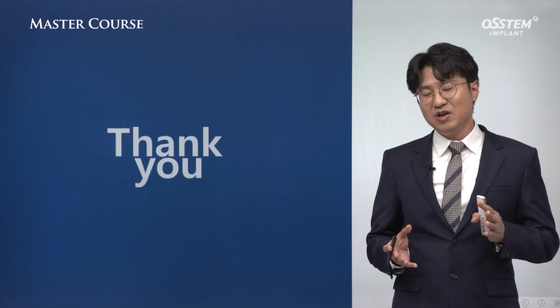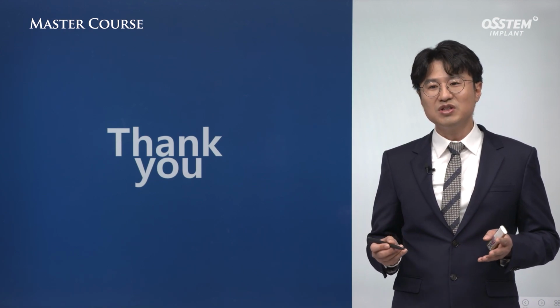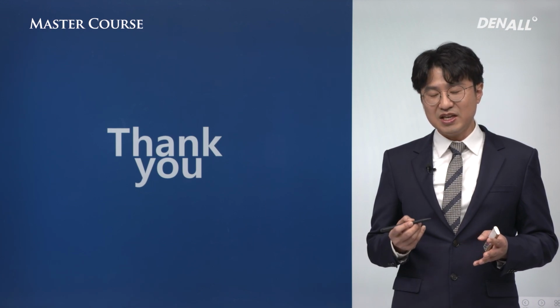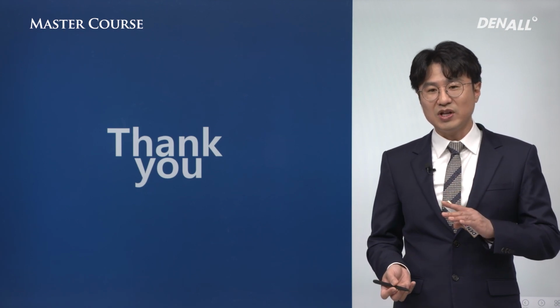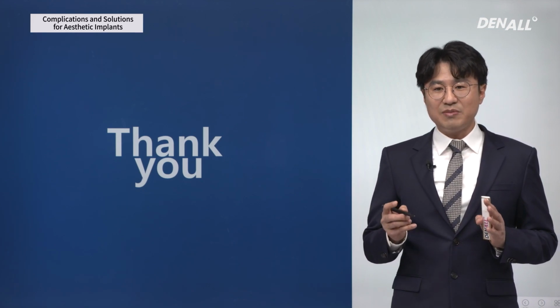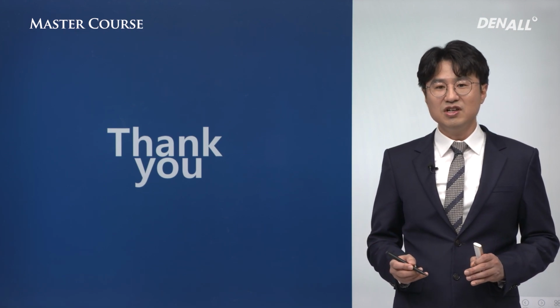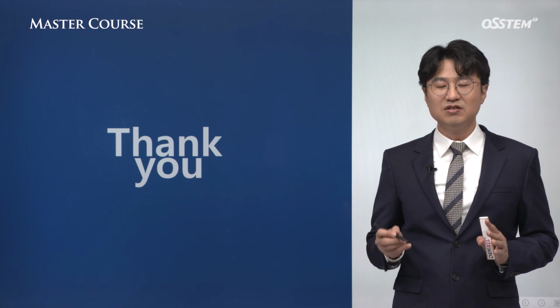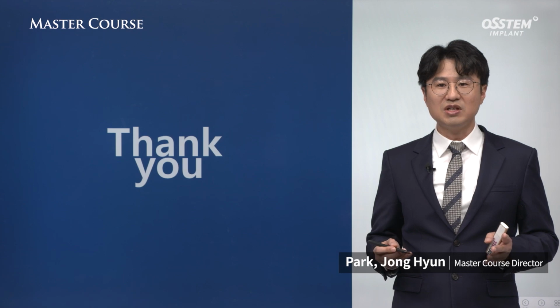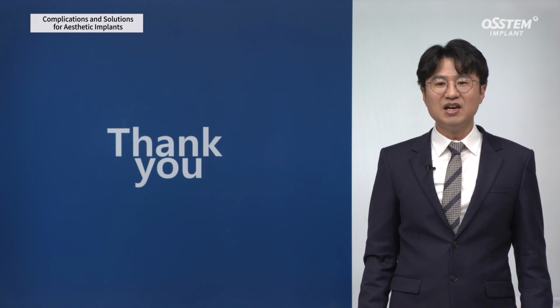This can lead to lower primary stability as the length and diameters can be reduced, with less stability at the apex. However, I can sacrifice other factors and I want to make sure the palatal screw hole is provided. I believe most of the mechanical complications lie in the failure of providing screw retightening rather than the crown implant ratio. To obtain a stable connection, we need to use authentic abutments. Maintenance of preload of the screw can be performed from screw retightening only. Therefore, we should not go aggressive in terms of implant diameters, lengths, and the primary stability, but we need to make sure that screw holes are positioned as palatally as possible.